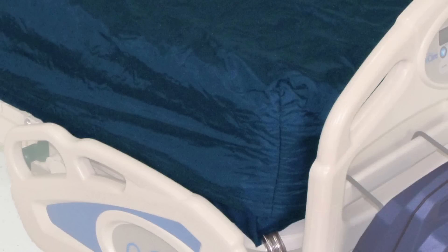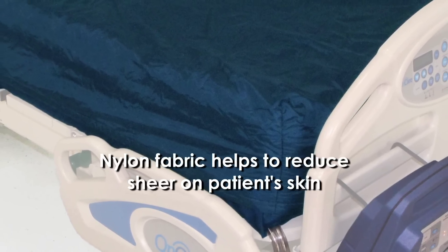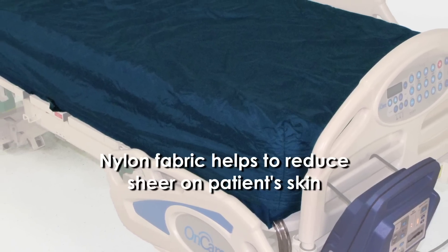The Dolphin mattress surface is made from a two-way stretch nylon fabric, helping to reduce shear on the patient's skin and allowing them to immerse into the surface.